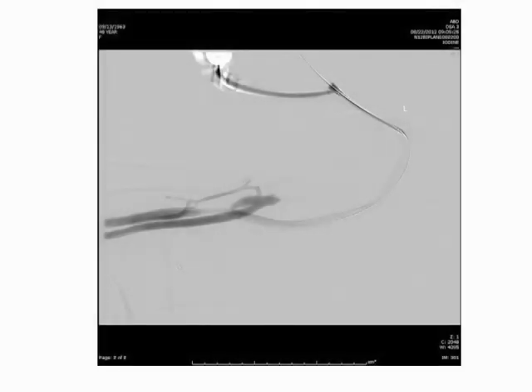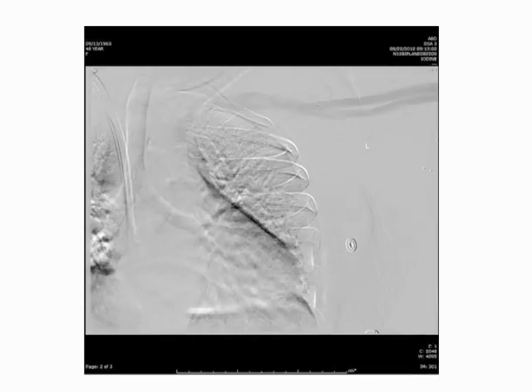This first case was found to have high venous pressures during hemodialysis, and the surgeon was consulted to evaluate and perform the angiogram. A 90% stenosis was found at the venous anastomosis from the graft to the axillary vein. It was angioplastied using a 6 mm by 2 cm balloon. The post-angioplasty angiogram has a residual stenosis greater than 50%. The decision was made to place a 6 mm by 5 cm bare metal stent at the venous anastomosis.